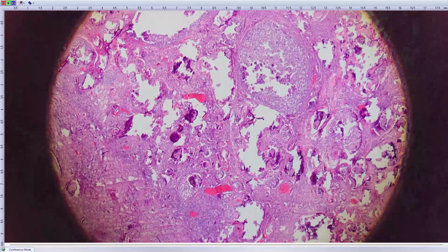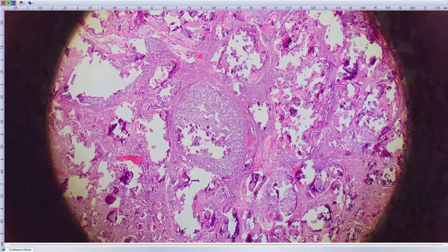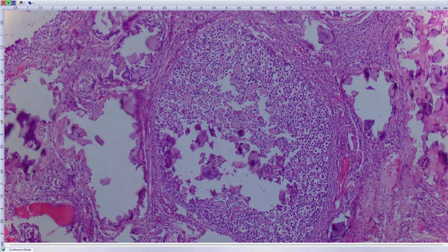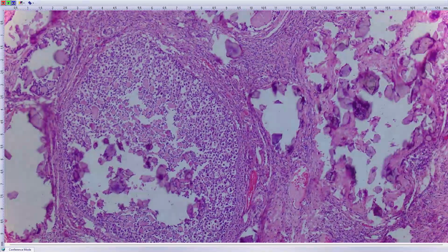And my last case is also a young girl, born 2008, and this is her ovary. This is an in-house case from today, so I don't have any immunostains available, but it is a beautiful lesion, and she also has gonadal dysgenesis. This is a mixed sex cord stromal and germ cell tumor arising in the setting of dysgenetic gonads. Once you see it, you will recognize it every time, because it has a very typical appearance. There is a mixture of germ cells and sex cord cells together with basement membrane material and frequently calcification.